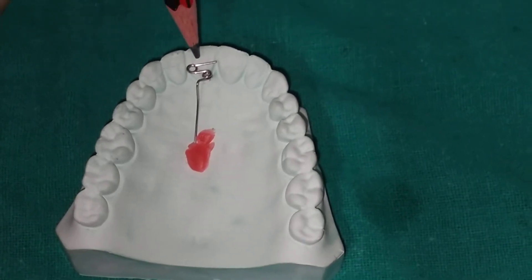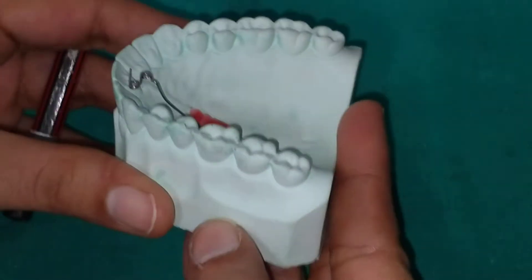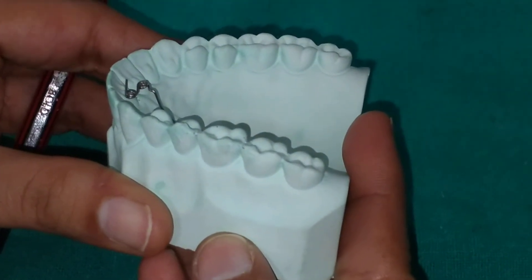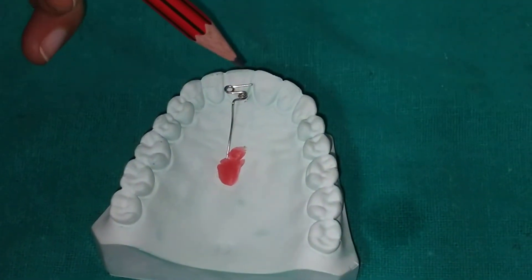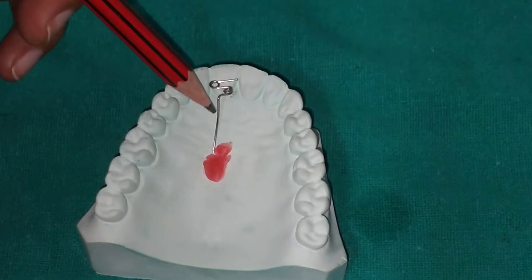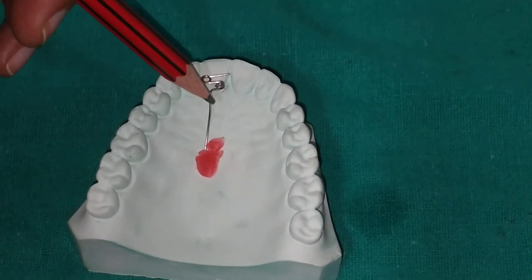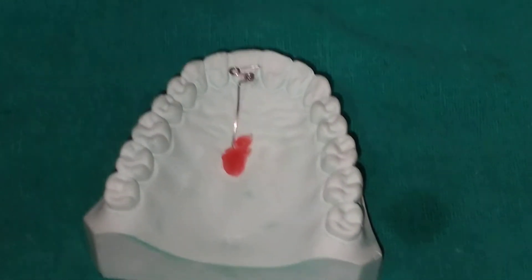This Z spring is at 90 degrees to the tooth intended for movement. This is the active spring part and this is the retentive arm, which is approximately one centimeter long. The spring part is perpendicular to the retentive tag and also perpendicular to the tooth intended for tooth movement.